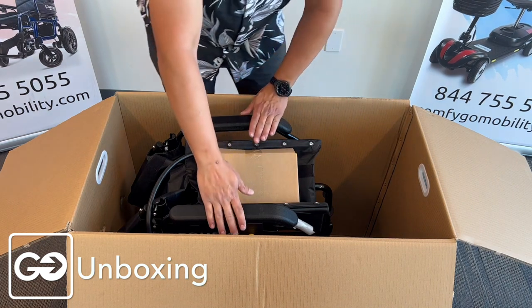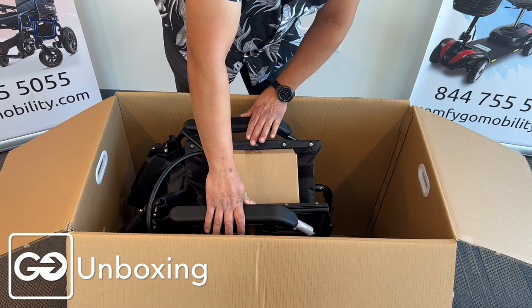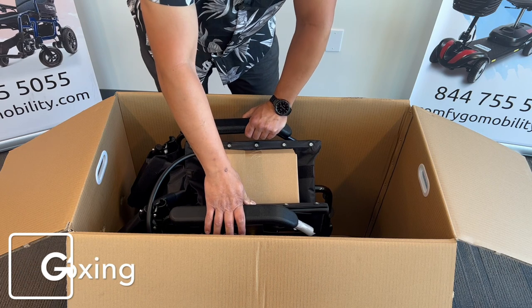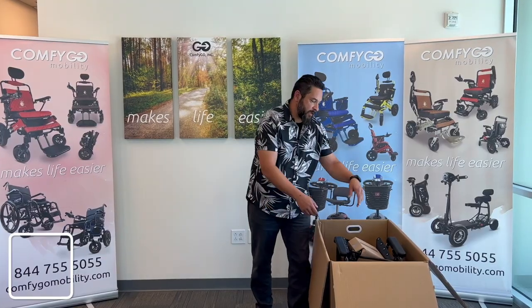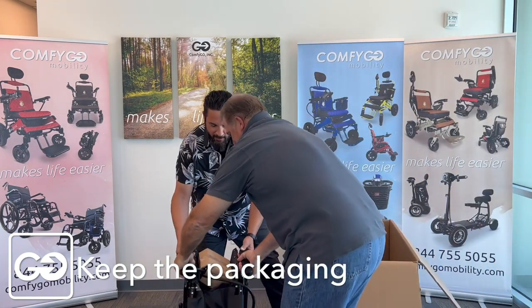Now this itself is about 40 pounds, so if you're strong enough to lift it up, you can definitely do that. But if not, I suggest team lifting — I'll get one of my friends here to come on by and help me lift this out of the box. So Jay, come on over and give me a hand here. Let me pull this chair out.